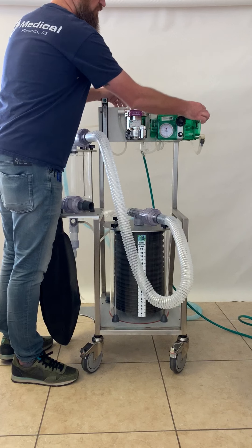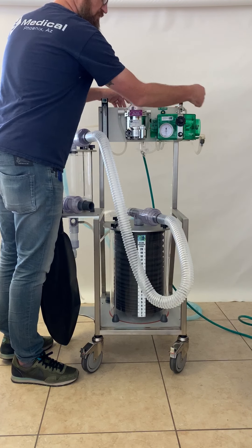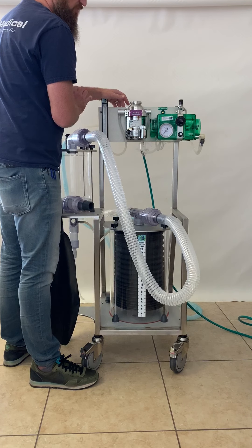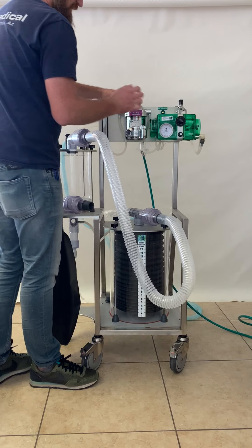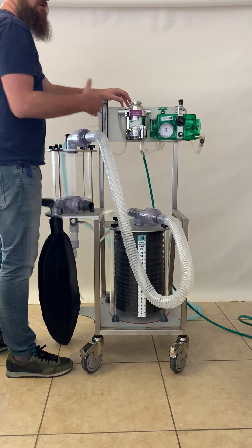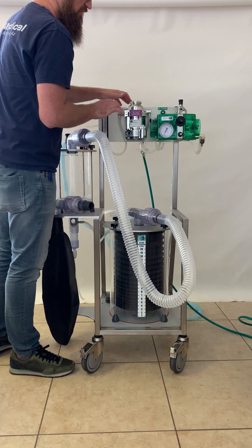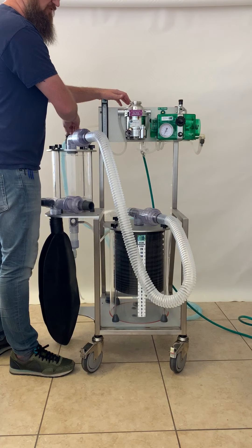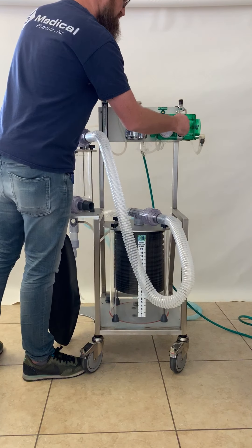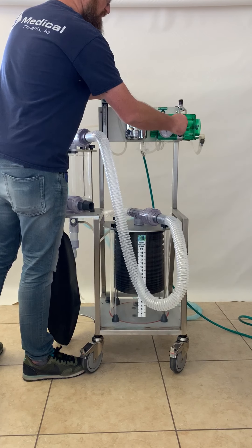To do a pressure check, we set it at a very low flow and a high pressure. There's a notch when you adjust the pressure higher where it stops. If you want to go above that, you have to manually pull it out. We'll leave it at the notch, which should be around 60 centimeters of water pressure, and trigger a breath at a very low flow rate. That shows us that we don't have any leaks — the pressure comes up very smoothly. If we do have a leak, say if I open the pop-off valve and trigger a breath, it will not complete the cycle and cannot achieve the pressure. So if it starts to hang up, we know that we have a leak.